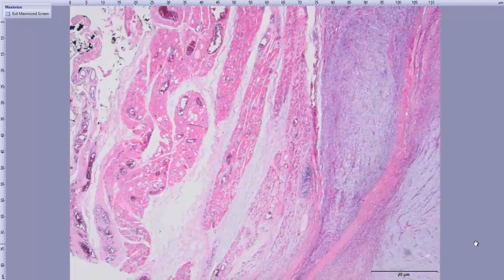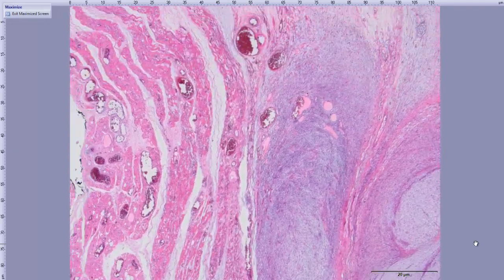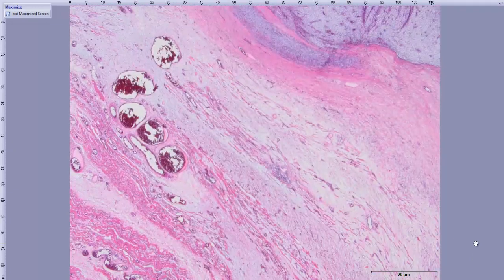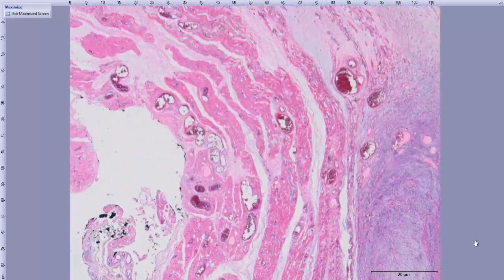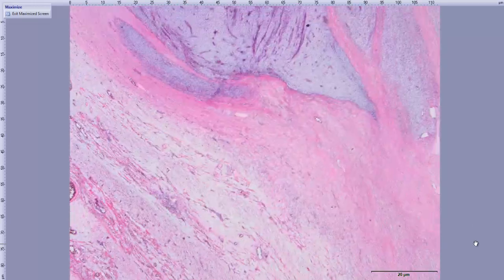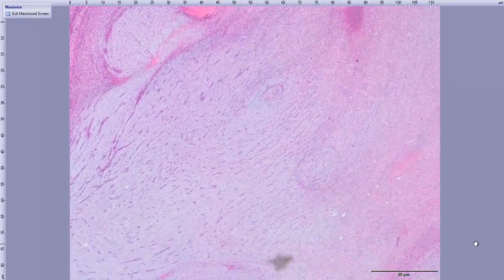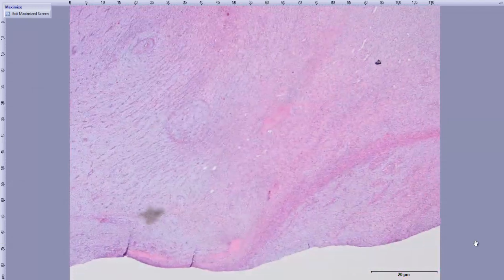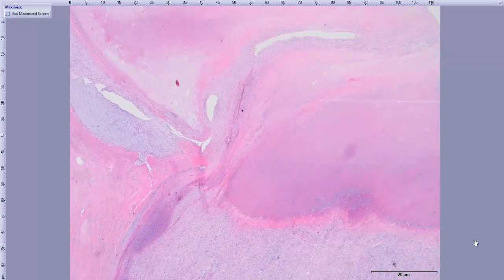So the tumor was infiltrative. There were some nodular infiltrations into the striated muscle, and as you see, the tumor seems to be myxoid and multinodular, or vaguely nodular pattern. Of course, as we see the necrosis, it exerts the malignant potential.